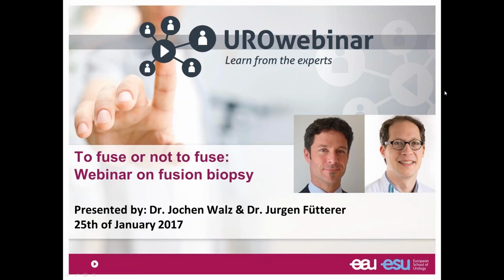So it's very important, if you discuss this with the radiologist, that we ask what kind of system we have. Is it up to date? Does it have the newest coil system? How do you assess quality? Do you use the European guidelines for MR imaging?